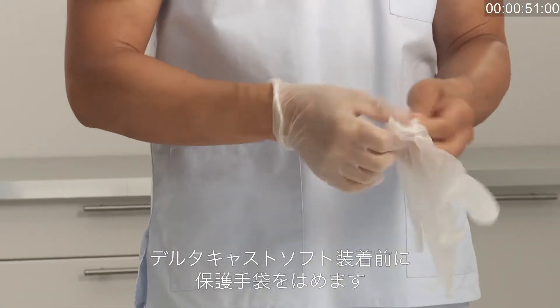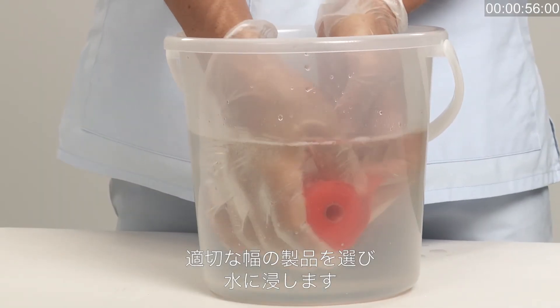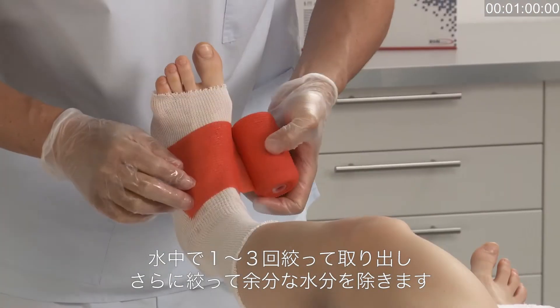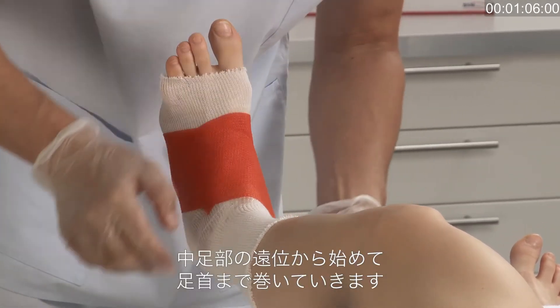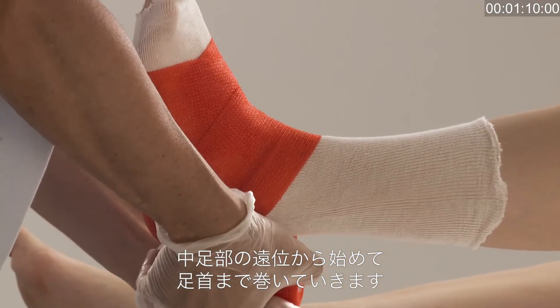Roll off over the ankle and smooth down. Put on protective gloves before applying Deltacast Soft. Choose the appropriate width of cast tape and dip the bandage in water. Squeeze between one to three times in the water, then squeeze the water gently out to drain surplus water from the bandage.